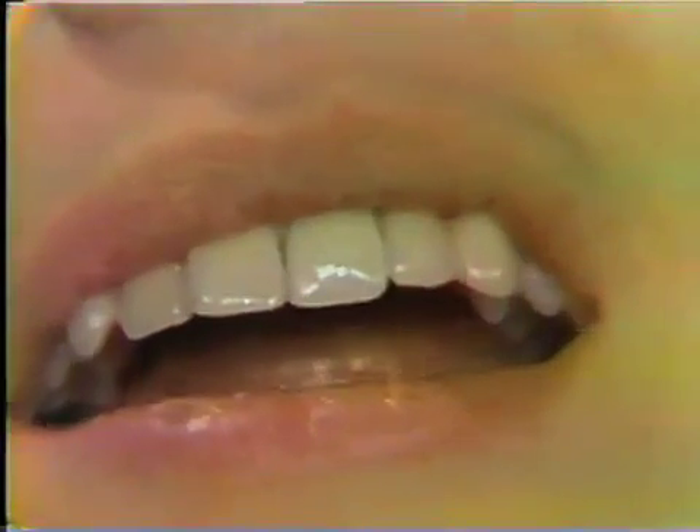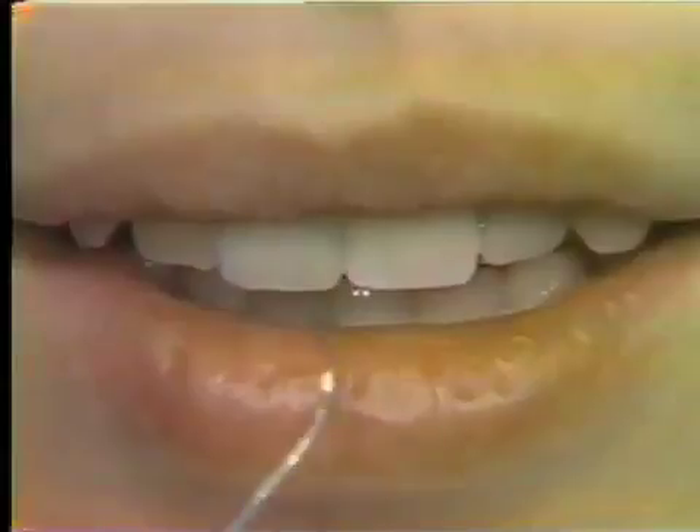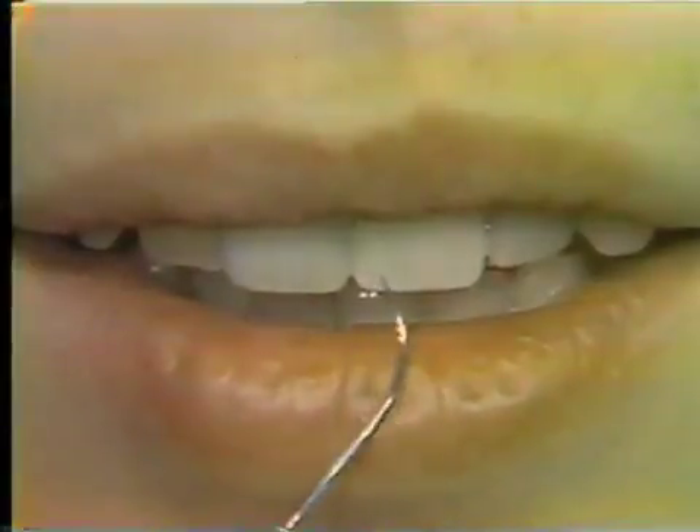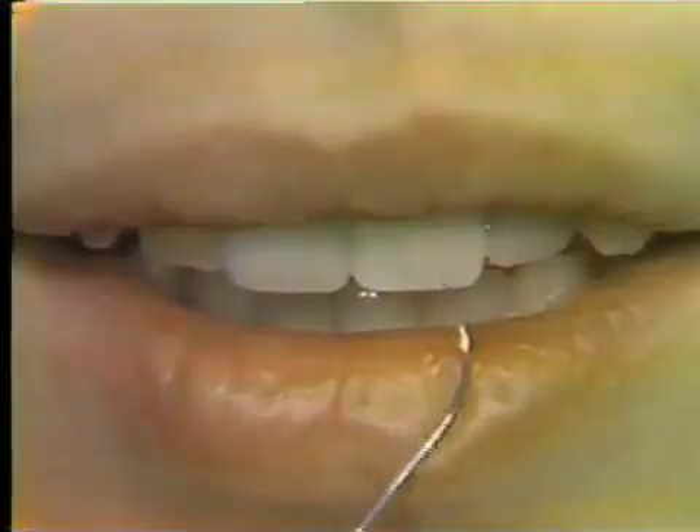Now we have the bridge back after it's been fabricated. You can see that this has a very aesthetic, pleasing look. It's not cemented — it's tried in to see if it fits properly. You'll notice that the facing matches the adjacent tooth, and we have tried to match the translucency and the gray areas on our facing. We've done this by placing a little pencil lead in the back of the pin facing before it was cemented. We're happy with the fit. We then varnish the teeth, and in this case we're using zinc phosphate cement, which is spun down the pinholes with a spiral lentulo spinning in the proper direction. When the pinholes are filled with this inlay-consistency cement, the bridge is seated all the way.